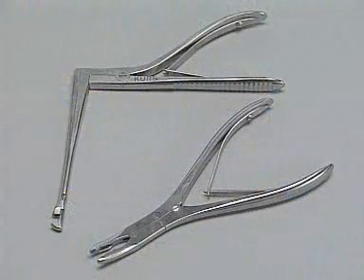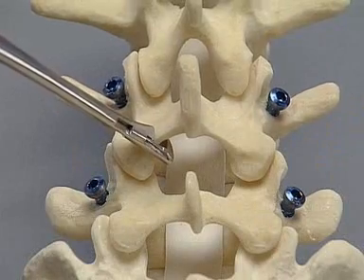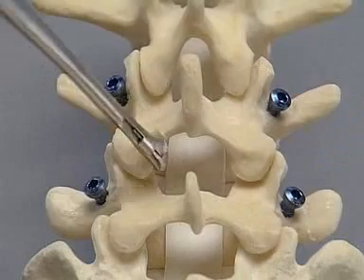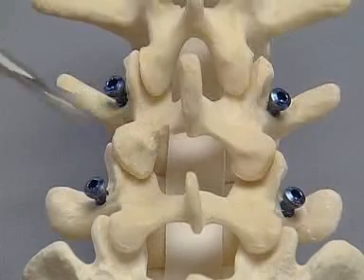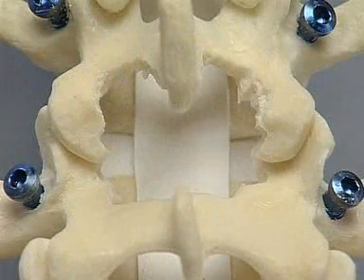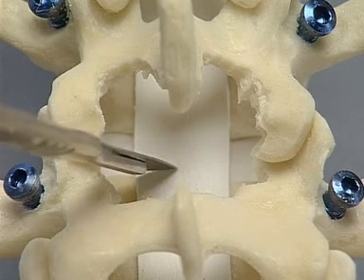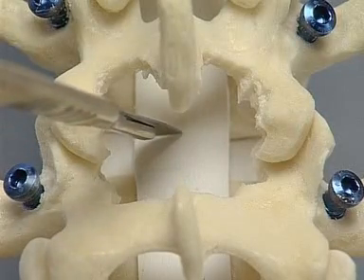The laminectomy punch and the rongeur are used to prepare the bone and disc space. An appropriate amount of bone is carefully removed from the lamina and facet joints to allow adequate access to the disc space. Enough bone is taken out to ensure that the nerve roots can be retracted without too much tension. Epidural veins are coagulated with bipolar diathermy. The nerve root is retracted medially and the posterior annulus is opened using a sharp scalpel, cutting away from the nerve root.